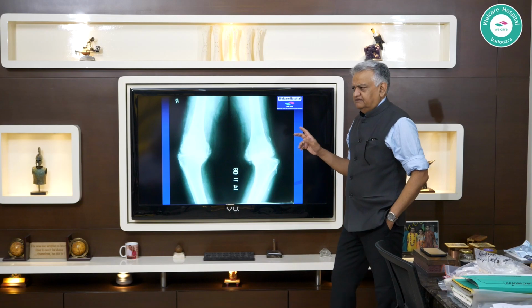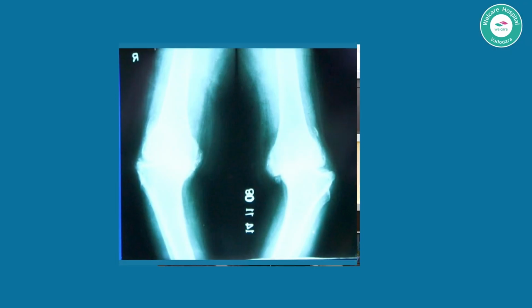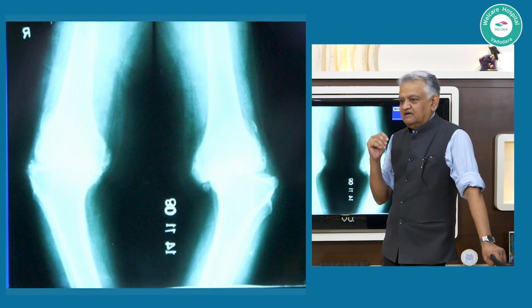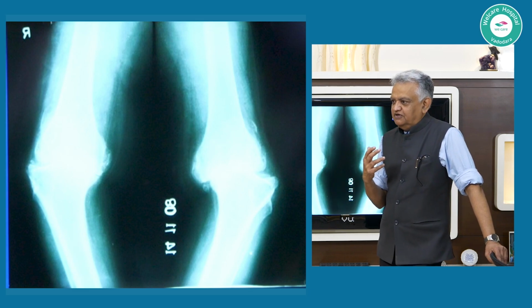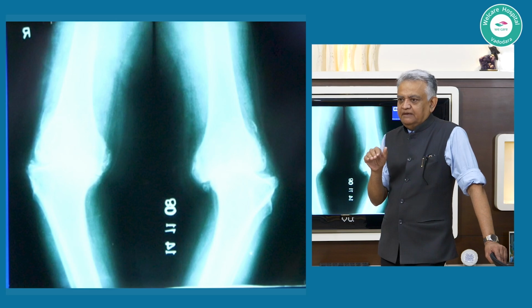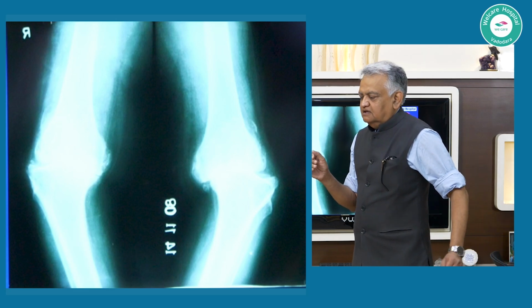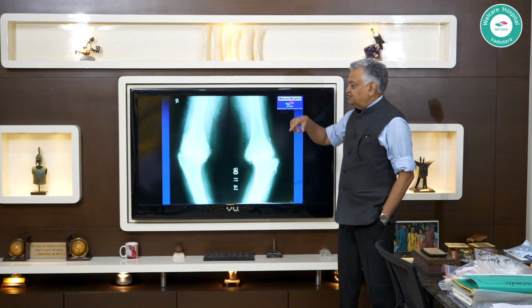But you will find many times that when you do your posterior femoral condylar cut in tight popliteus, you will end up transecting the popliteus tendon as well. In my early days, I used to get very worried about it, you know, and flustered that, oh, my saw blade ended up damaging that popliteus tendon. And later on I realized it doesn't matter. It heals up by fibrosis, and the overall stability of the knee is adequate enough to keep the popliteus tendon in position in the post-operative phase, and then the fibrotic healing allows it to join.